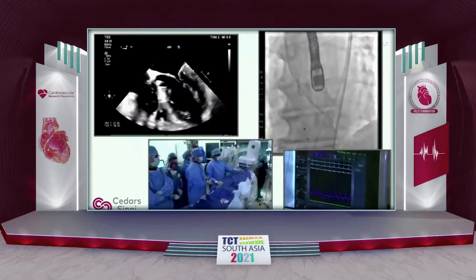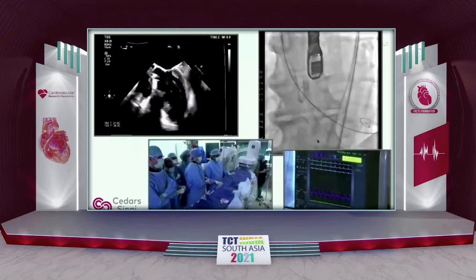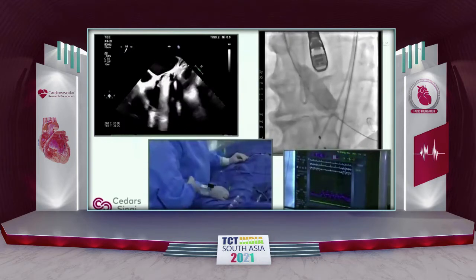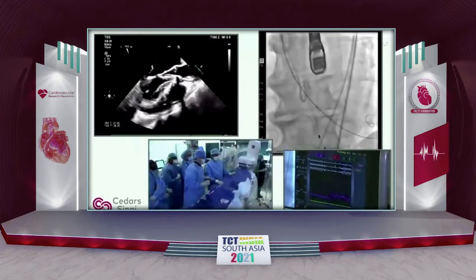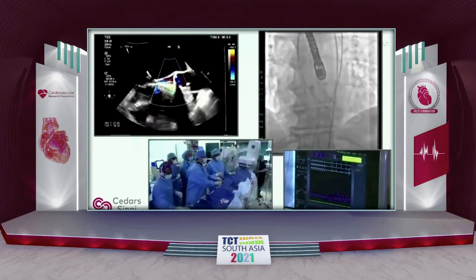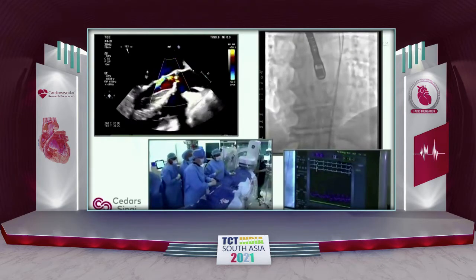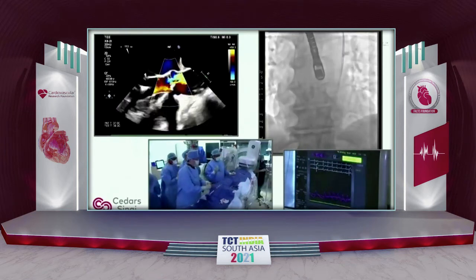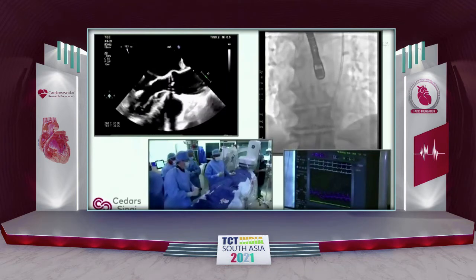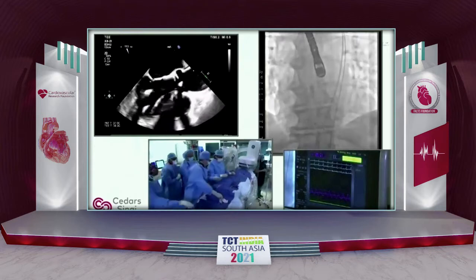So, okay, let's go ahead and do some rapid pacing, please. Pacer on. Okay, let's go up. Down, please. Open. Off, please. All right. Okay, so let's just take this out. Now, this is just a 20 millimeter balloon, and I wanted to ask you, Saurabh, and Dwayne, what do you think? What do you guys pre-dilate, or what is your practice? Dwayne, Saurabh, yes, please.